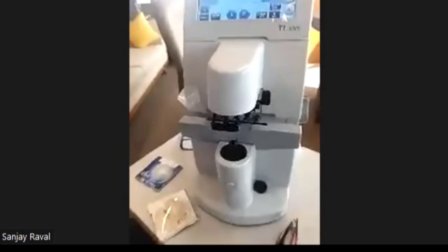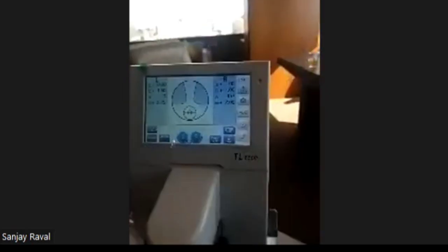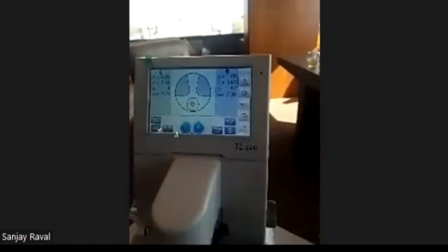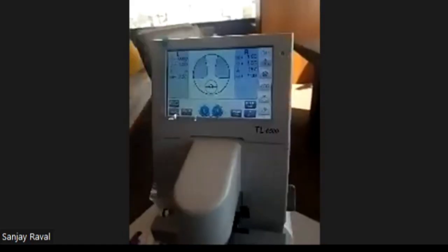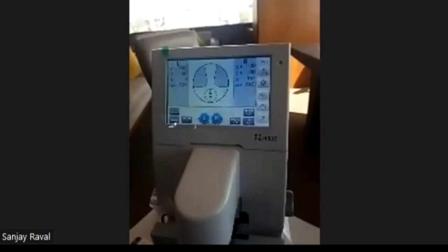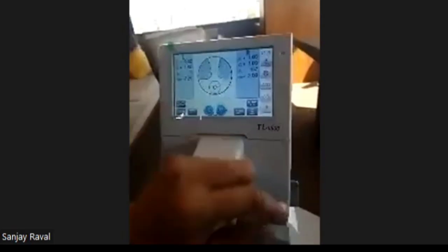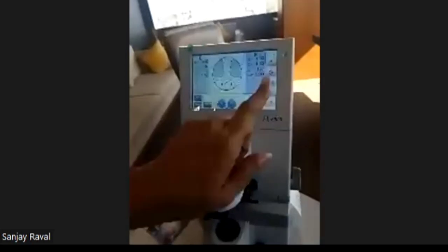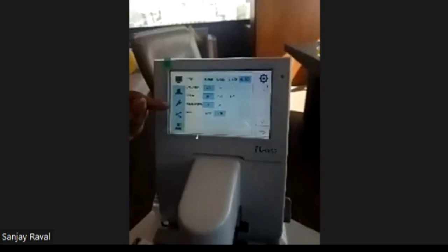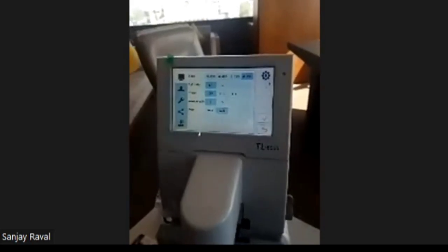Now coming down to the measurement part, it is briefly explained. Individually, at the time of installation, normally we provide the video demonstration as well as on video call. We are always available around the clock. But going for the other parameter setting of the equipment, there is a key given over here, that is the settings. Display settings. This is the display setting, the measurement setting, the system setting, and the interface setting.